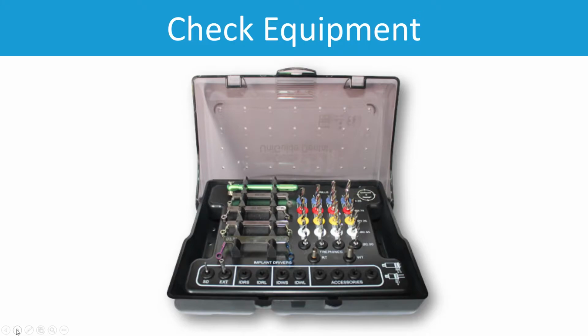So our check equipment. This is the equipment you'll be using, and I'll be taking you through the various stages. But one of the first things you can quickly glance at when you look at your equipment is, are all the spaces filled? Do you have all the spoons you need? Are the spoons in increasing size? Are the burrs all properly there? Are any burrs missing? If you look at this, you can see how there's a gradual increase in the length of the burrs.